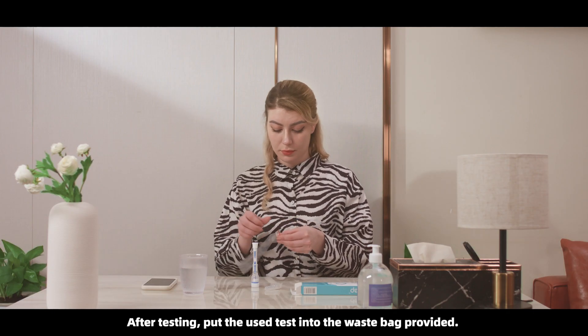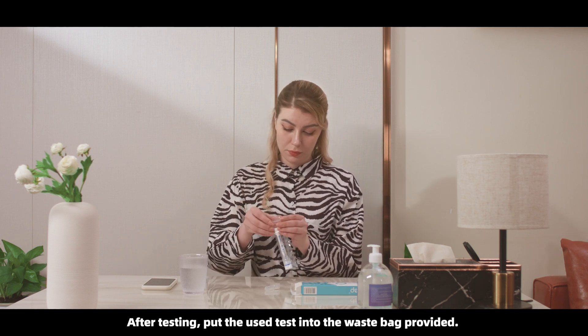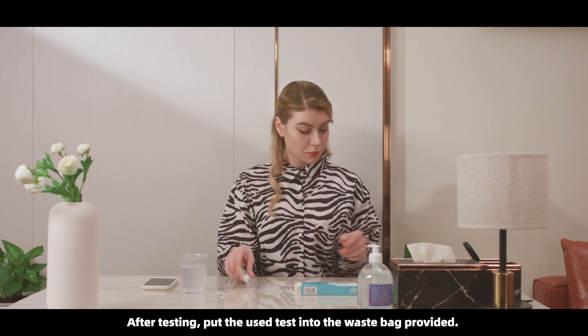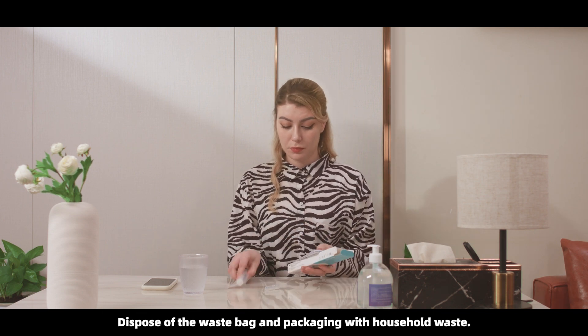After testing, put the used test into the waste bag provided. Dispose of the waste bag and packaging with household waste.